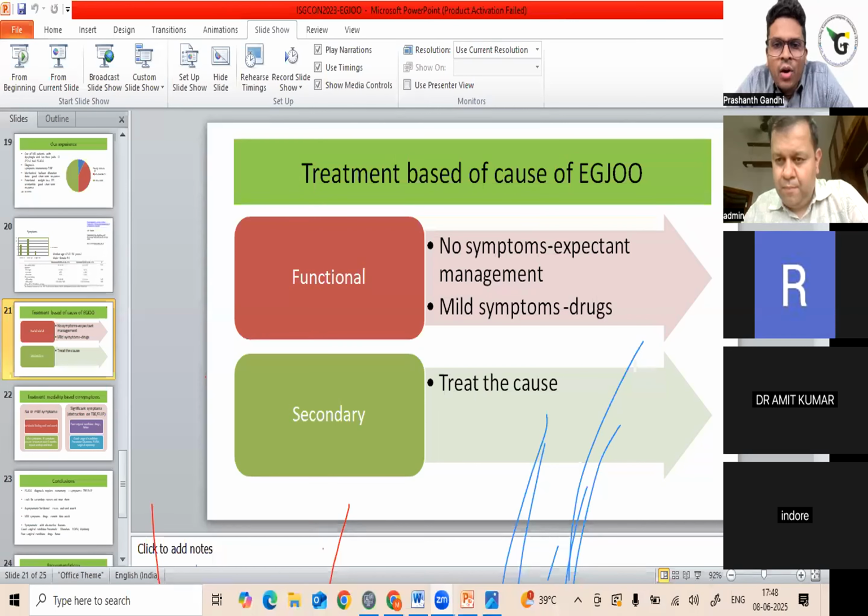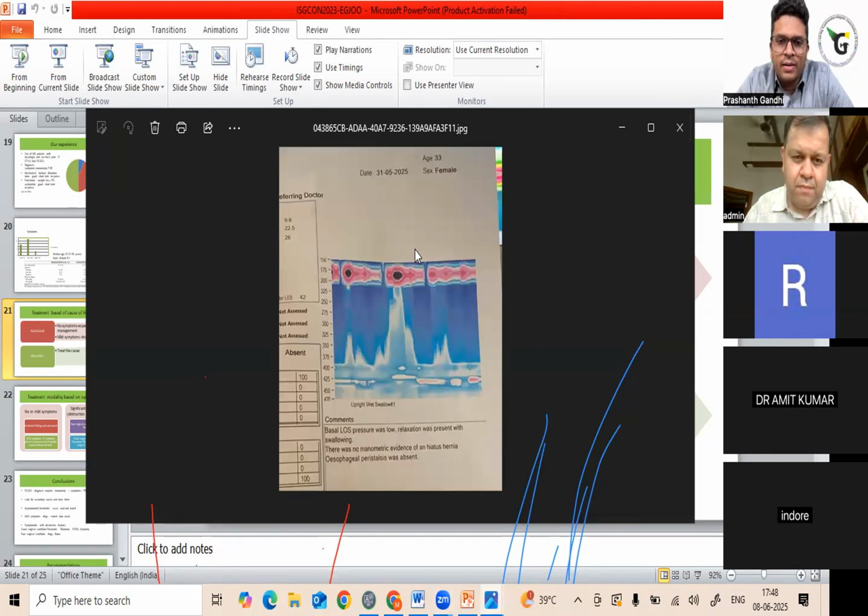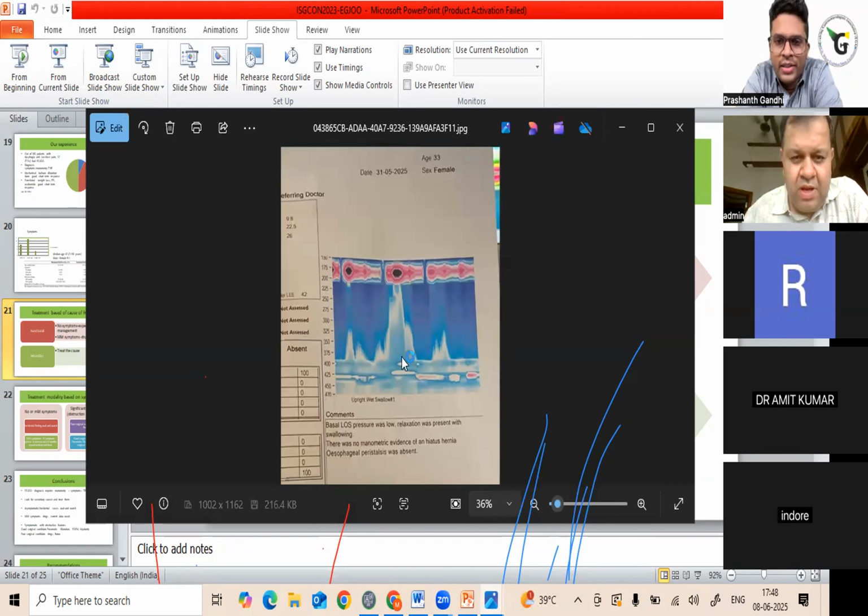Also, what are the guidelines? How frequently should we be doing TBE? He has posted a picture, sir, if you can go through. And is there any role of acotiamide in post-myotomy dysphagia? That's his question. If you can just show the picture, sir. Yeah, this is the picture. Post-fundoplication.